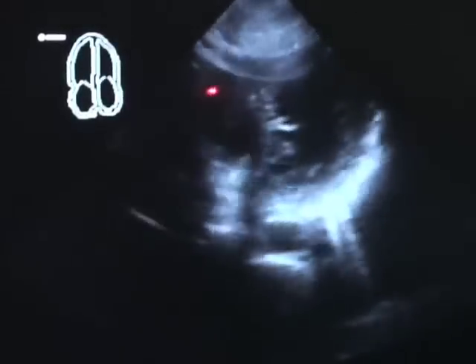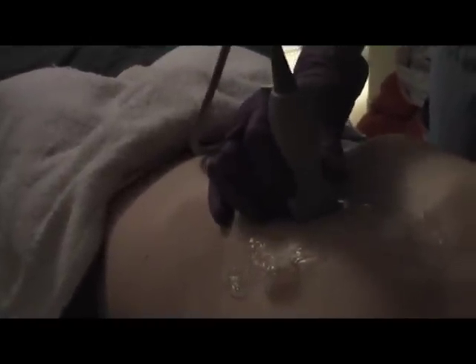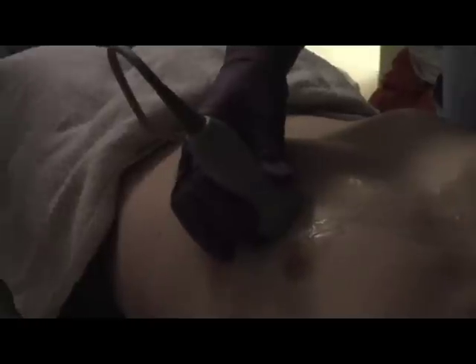Of note, when you start to see the right ventricle, you can rotate the probe and open that up. And then a little bit lateral.